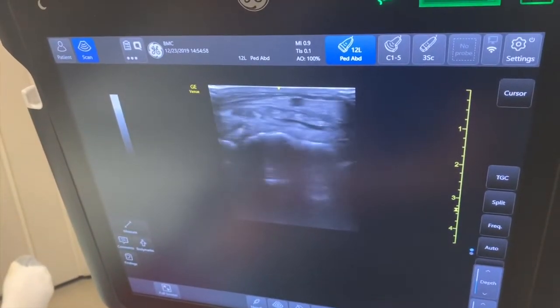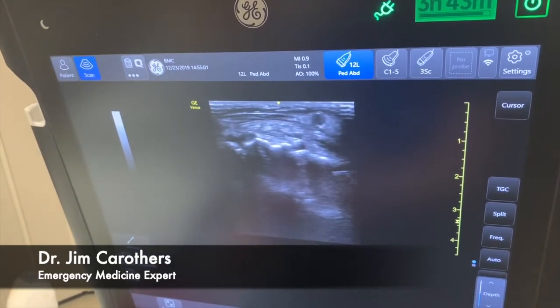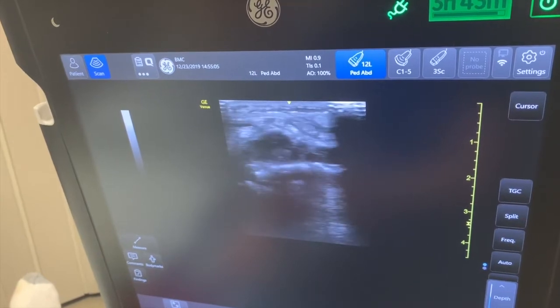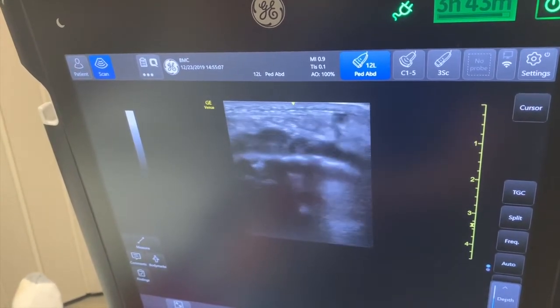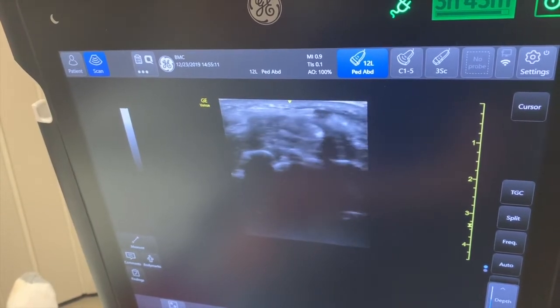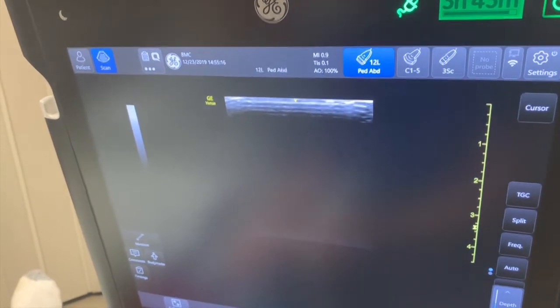A lot of this looks like it's just subcutaneous. You can't move your wrist like this without really hurting, eh? No.